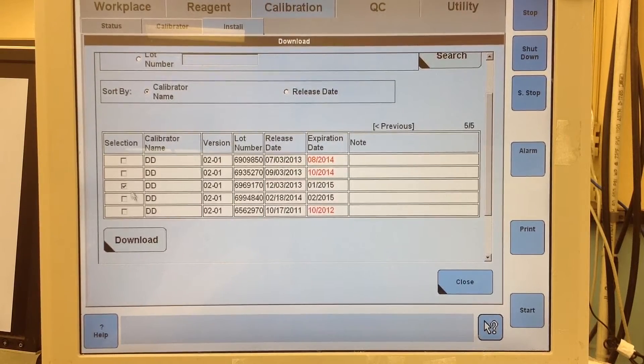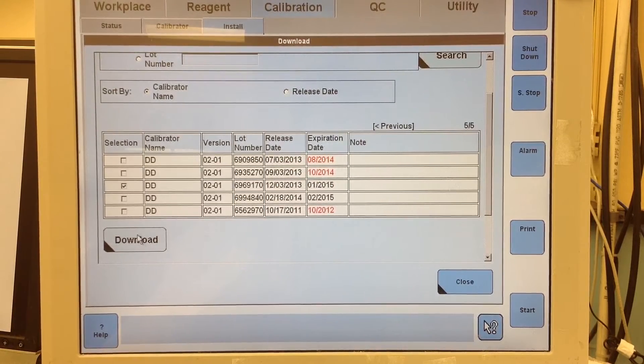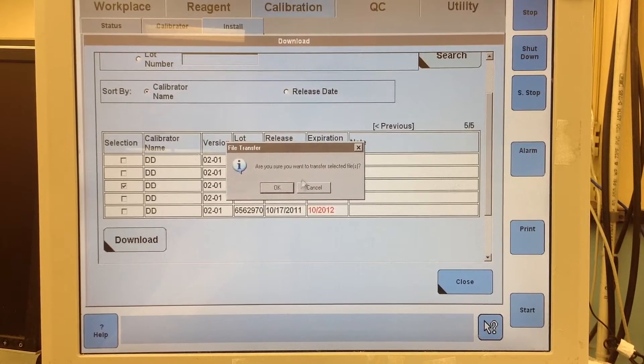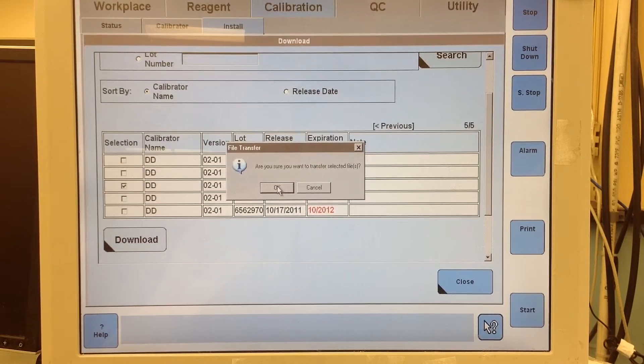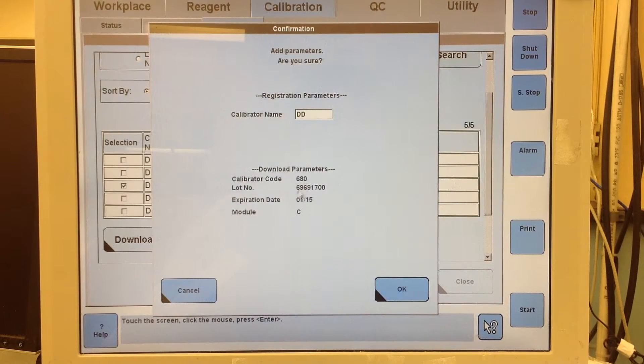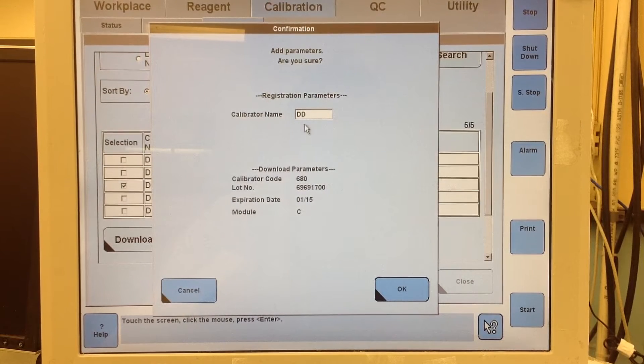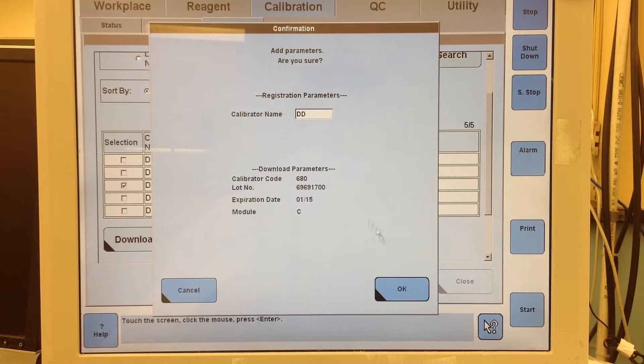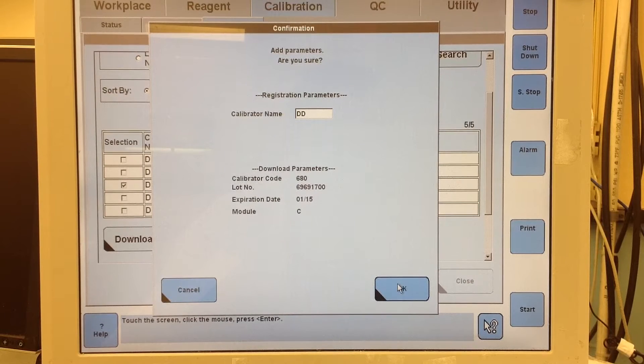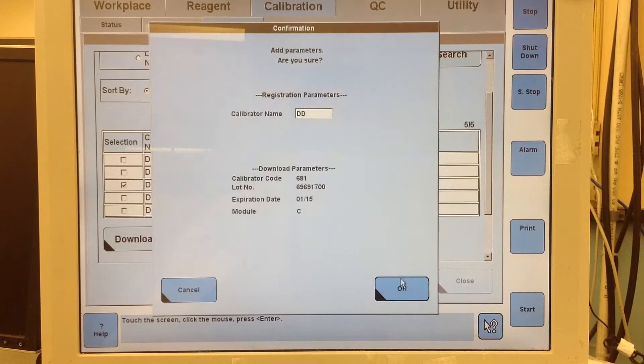After you select the D-dimer calibrator you want to download, you have to click download. It's going to ask if I'm sure I want to transfer. Yes. So that's the calibrator name that it's going to do. It's going to start at 680, which was the starting of my last parameter.